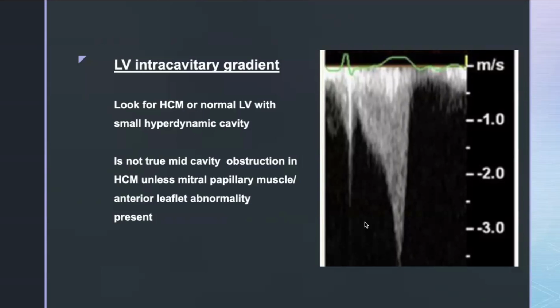And that's just because it has less clinical significance. And for the reader, it might make somebody a little less worried if we just say it's obliteration rather than something pathologic related to obstruction. And I think that's actually all I have.